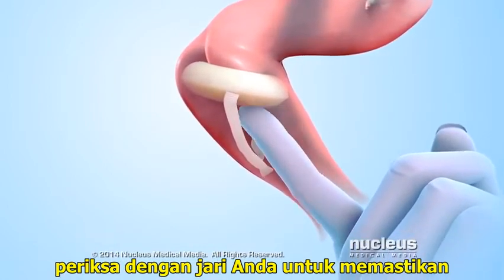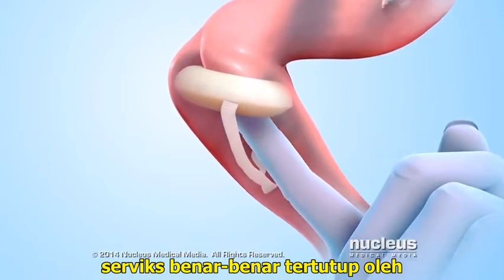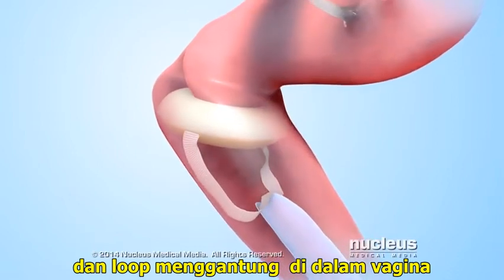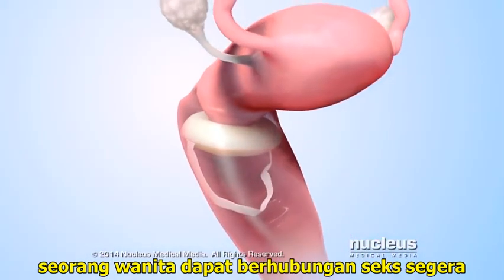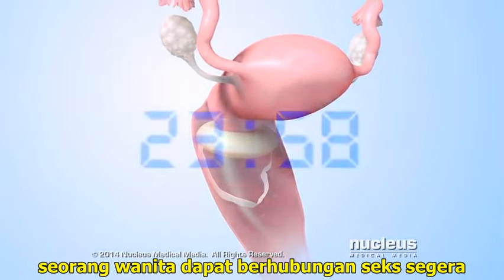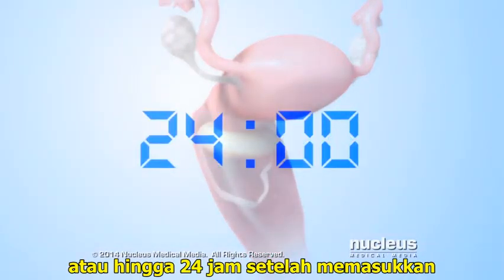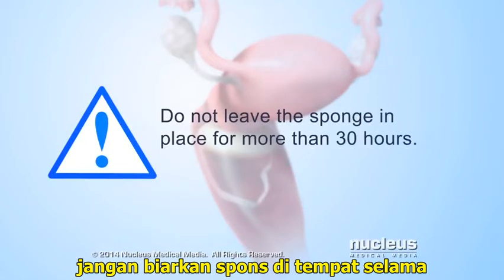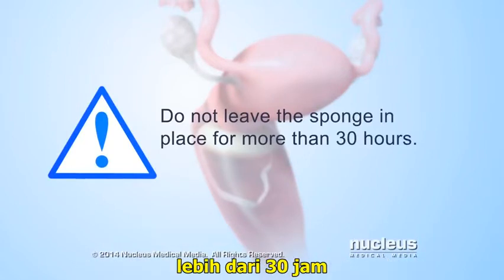Check with your fingers to make sure the cervix is completely covered by the sponge and the loop hangs down in the vagina. A woman can have sex right away or up to 24 hours after inserting the sponge. Do not leave the sponge in place for more than 30 hours.